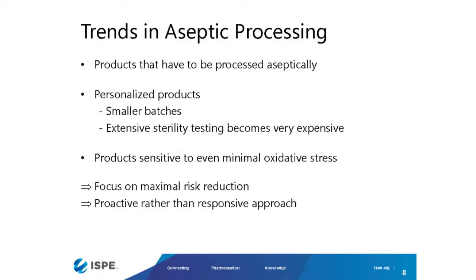We are seeing many more personalized products, which means we are doing more smaller batches. Extensive sterility testing becomes more expensive. This is kind of negative, for example, for E-beam, which is really great for large scale, but for small scale, it's probably too expensive.